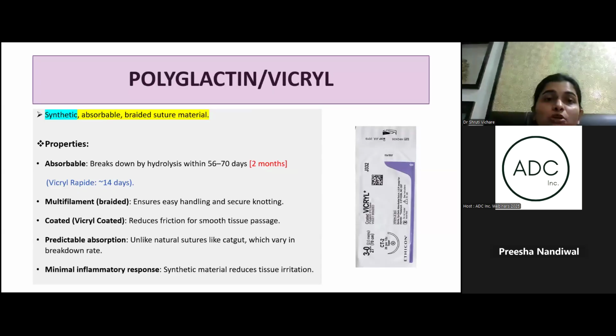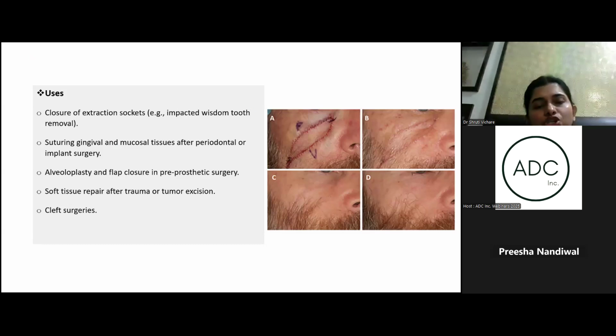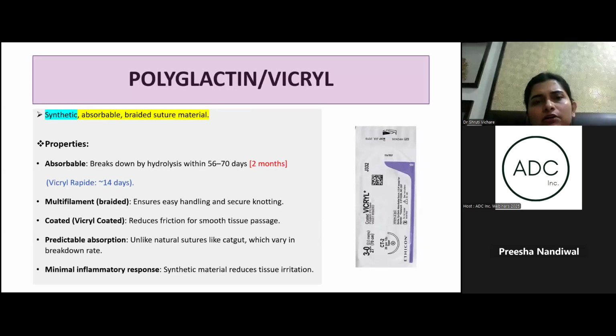Although, one more problem associated with gut sutures is sometimes the suture ends, when you cut the sutures after the knot is tied, become a little pokey at times. So you sometimes have to advise anesthetic gels in those areas when they get pokey and pierce and irritate that area. So that is one more problem associated with the sutures.